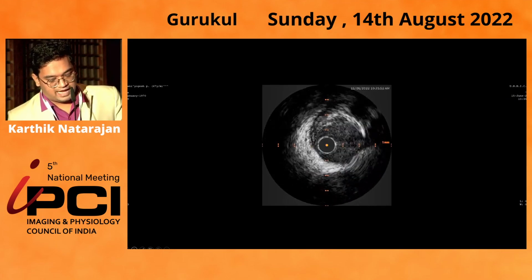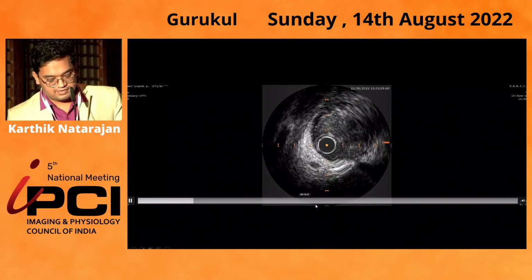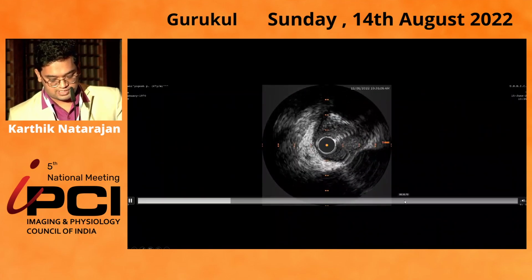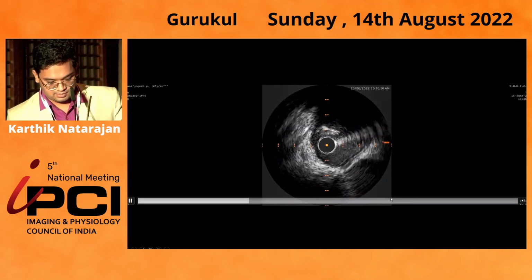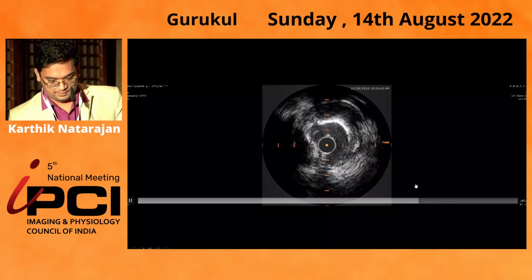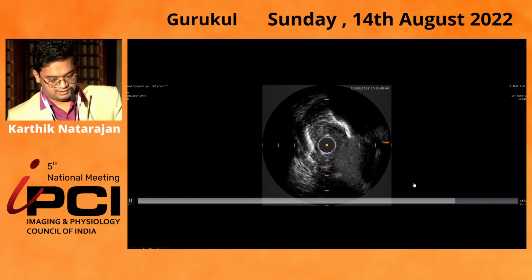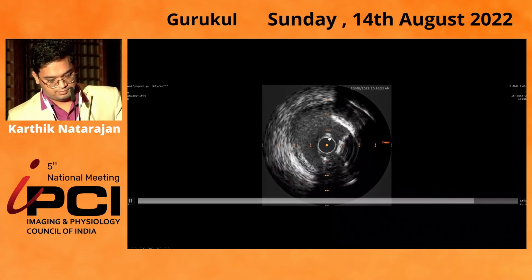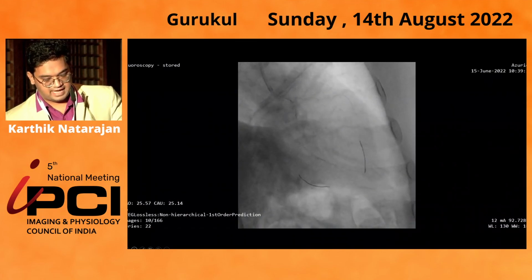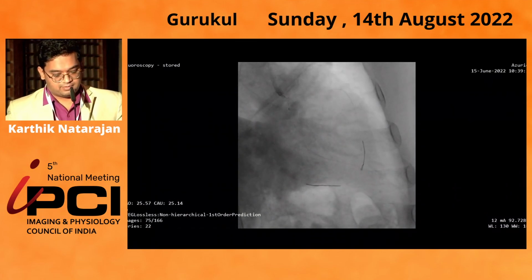We then had to dilate the ostium of the circumflex to allow the IVUS passage. Again, we could see a calcified nodule throughout and very severe stenosis at the ostium of the circumflex. It's very calcified, and so it's basically a Medina 1,1,1 bifurcation disease with calcium. The minimum lumen diameter was around 2 millimeters.